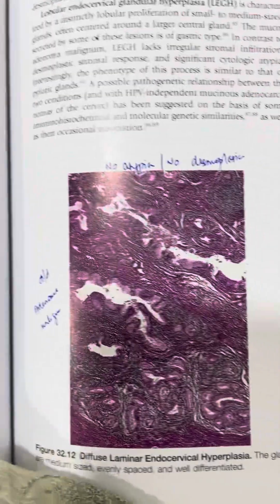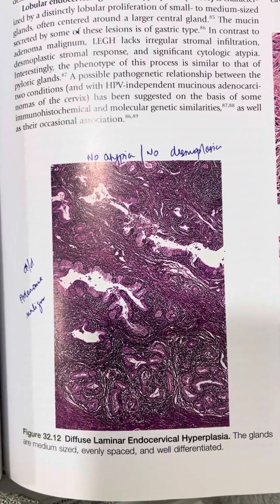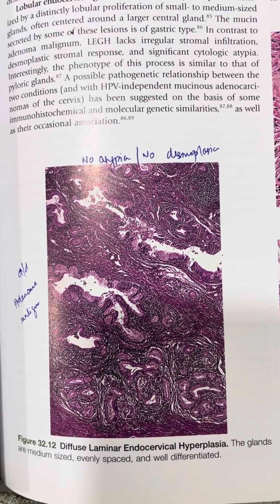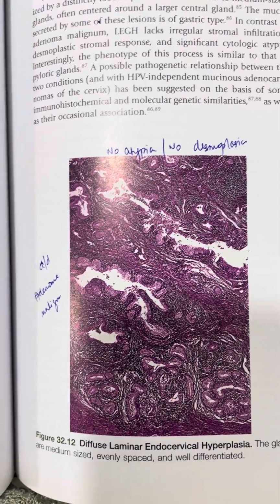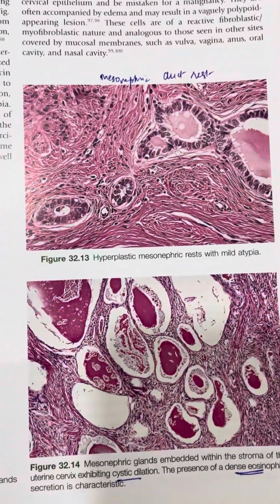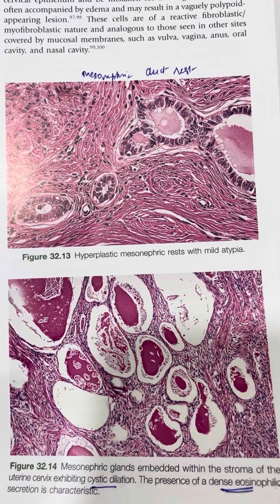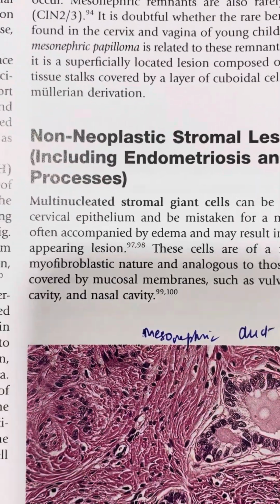Then the next important condition is the diffuse laminar endocervical hyperplasia. That is proliferation of glands, but there is no atypia, no desmoplasia, because we have to differentiate this from adenoma malignum. Then another picture of the mesonephric duct rest having the dense inspissated secretions and the single cuboidal lining. Then sometimes you can also have the multinucleated stromal giant cells in the cervix.